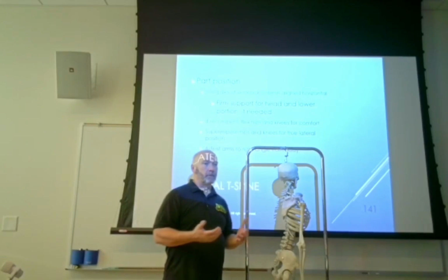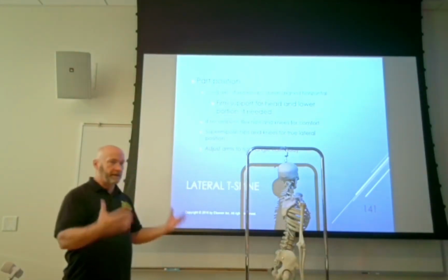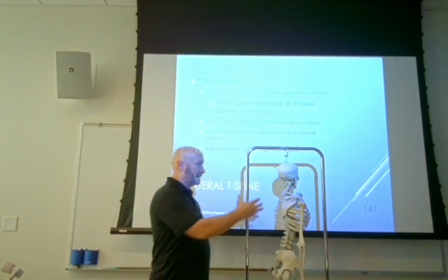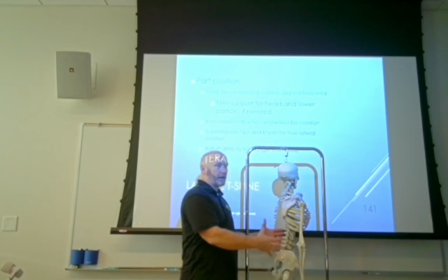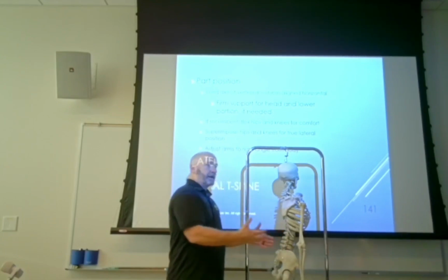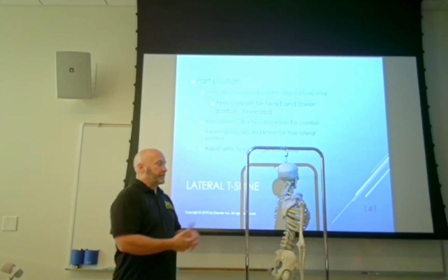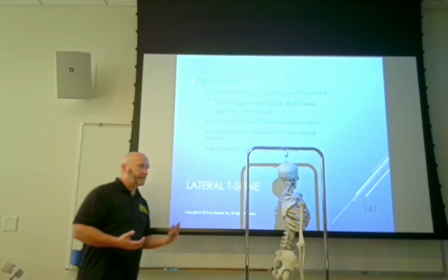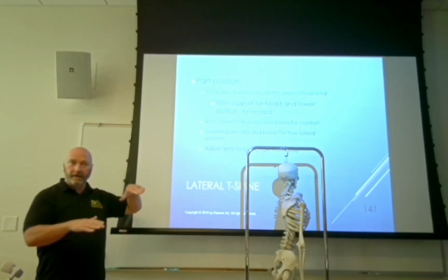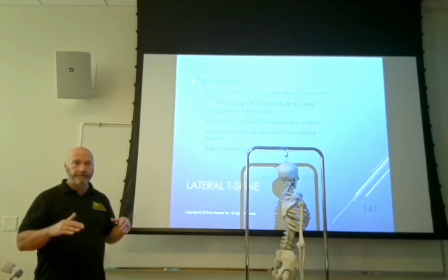And so you've got to do one of two things. First off, if you've got a patient that just doesn't have any, I don't mean this to sound tacky, doesn't have a whole lot of curves to them, be it male or female, then you might not have to take any kind of precautions at all or any additional steps. But take a step back, and if it looks like you've got an angulation on that spine, what you may have to do is build the spine up to make it parallel.